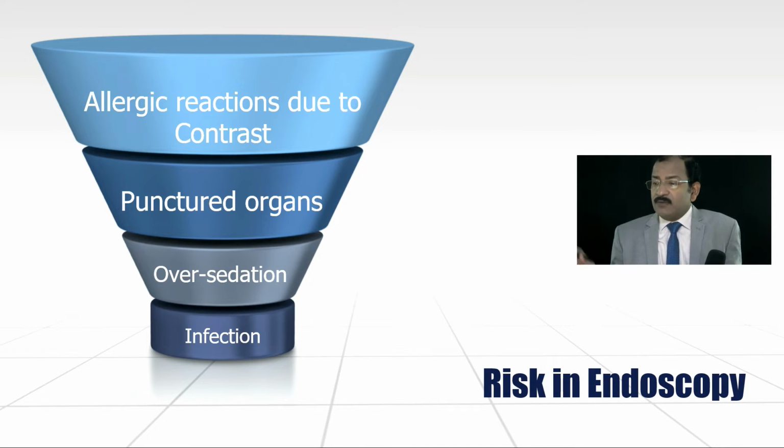So that is why in developed countries, the shaft part of the endoscope is now coming disposable, which you can attach, use in one patient, then detach and throw away. The shaft part, which goes inside the abdomen, is disposable. So you don't need sterilization, every time you can use a new one. But of course in our country we cannot do that, so we use Cidex.